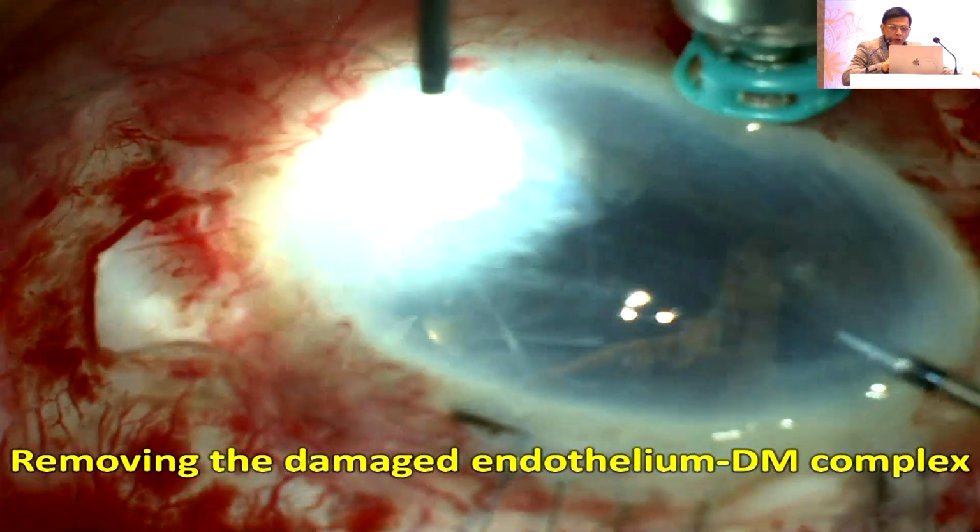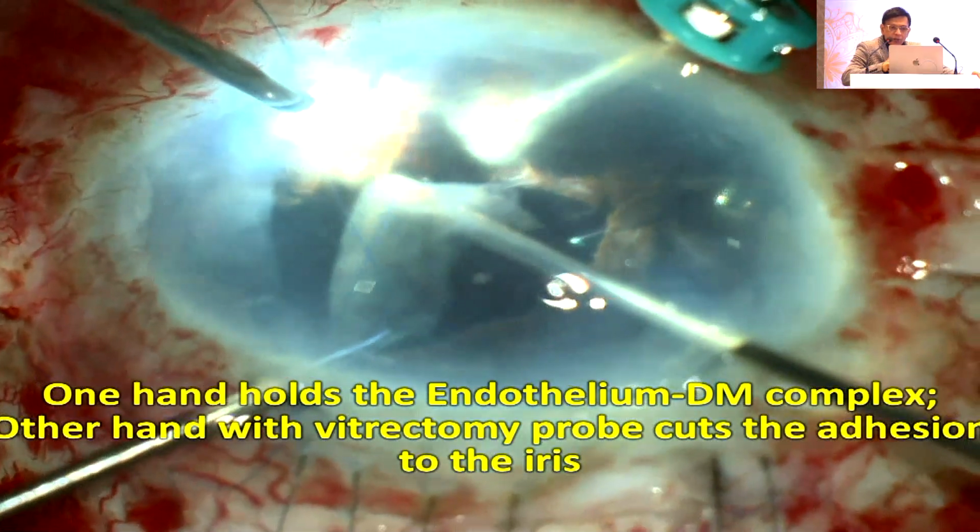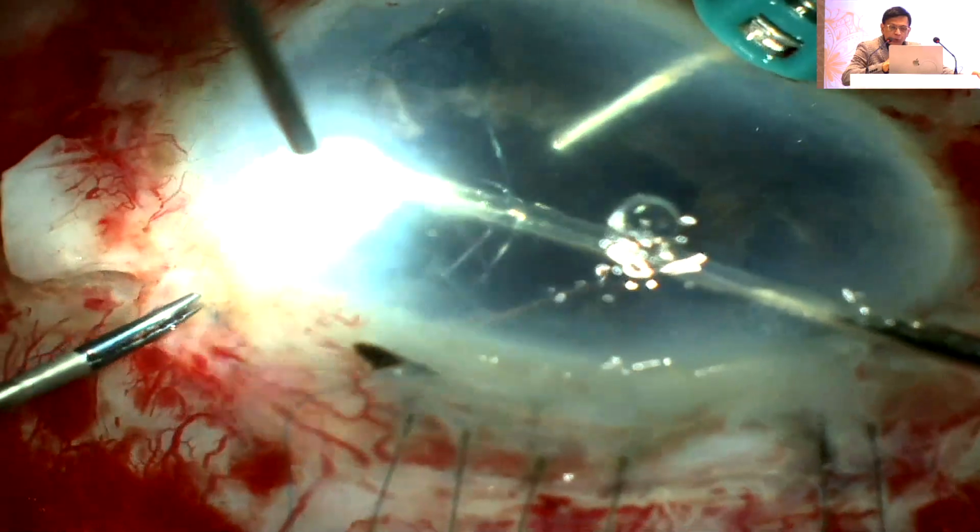You see how bad that Descemet's endothelial complex is? And most of this fibrotic tissue is also stuck to the iris, as you can see there. So you would hold it with one hand, and with the other hand, I'm cutting it with a vitrectomy probe.